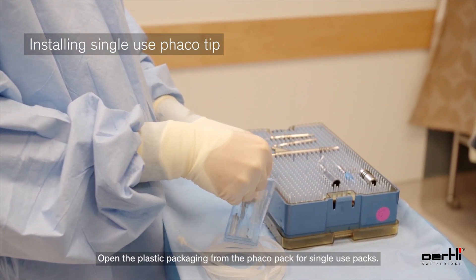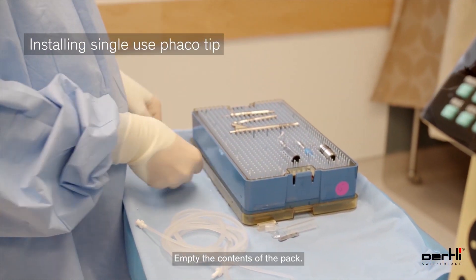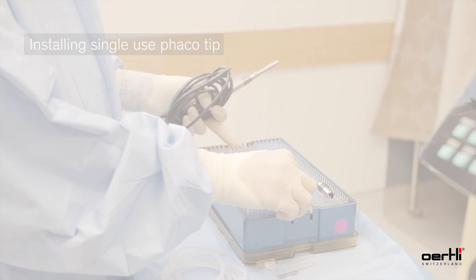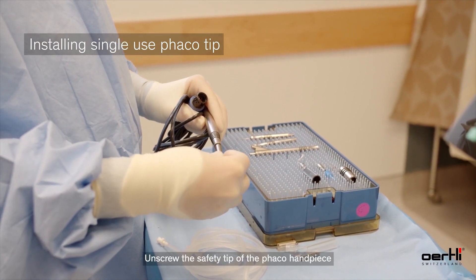Open the plastic packaging from the FACO pack for single-use packs. Empty the contents of the pack. This will include the FACO tip, the test chamber, and the disposable wrench. Remove your FACO handpiece from your tray.